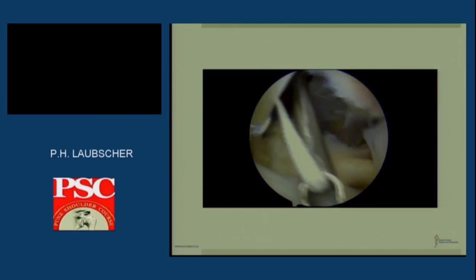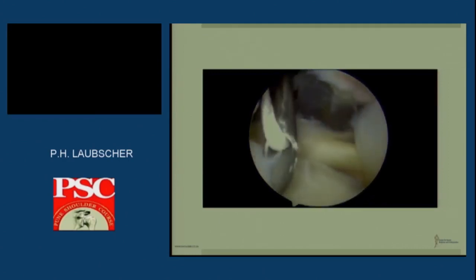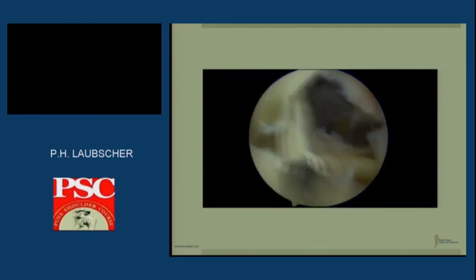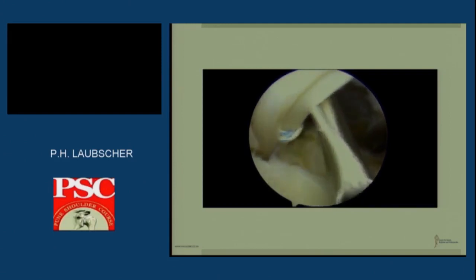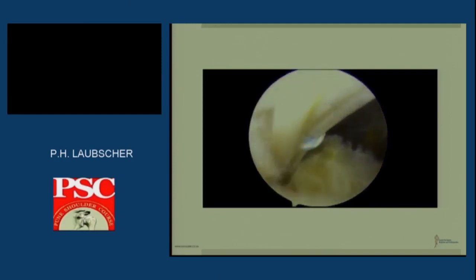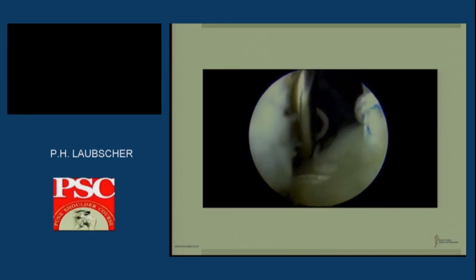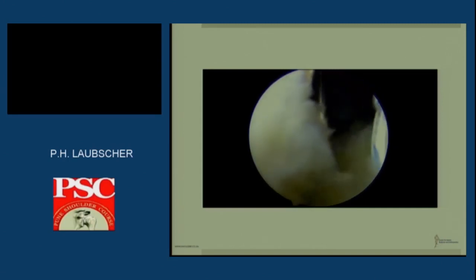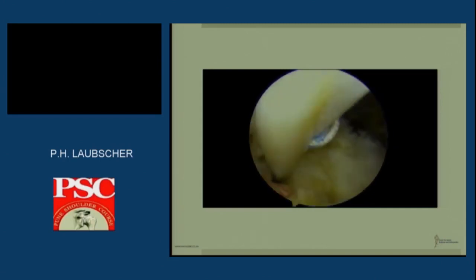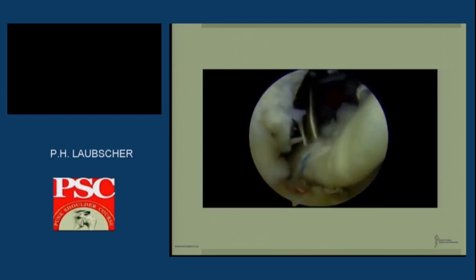Once I've done that, I can then proceed inserting an anchor. I also prefer lately to use a screw-in anchor that allows bleeding from within the anchor site. I believe that assists, because the principle of this technique of mine is for me to try and have the tendon heal in the groove. So I fixate it with my sutures. You can see again a lasso loop, and then to attach it in the groove and for it to heal there.